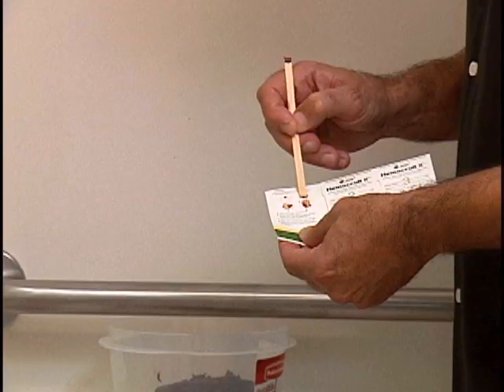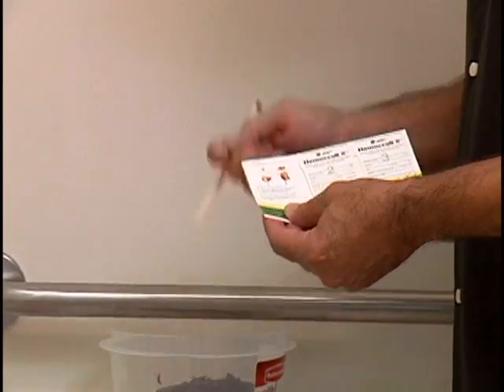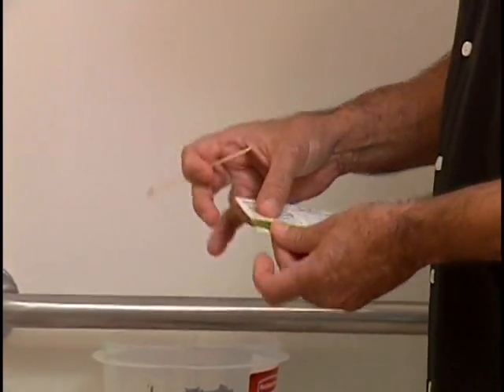Avoid thick specimens, as this prevents adequate light from penetrating the paper and makes the results difficult to interpret. Close the front flap of the cardboard slide.